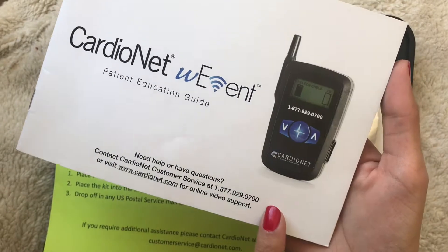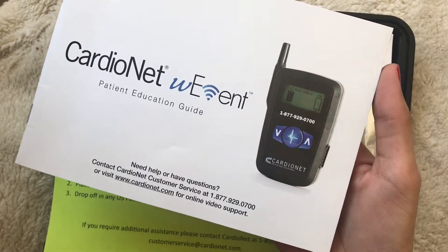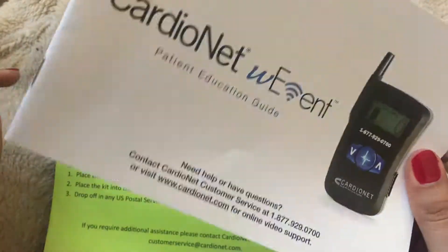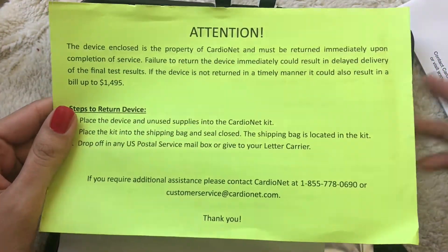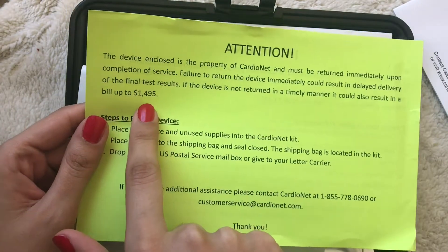If you have additional questions you can contact the number at the bottom — they're 24/7 support and I've spoken to them; they're great. There's also a neon green paper that reminds you that if you don't return all of the equipment they can charge you up to $1,495.